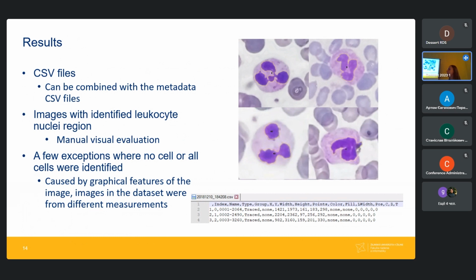Well, this region is what was marked in the labels from the expert. So this is just marked as leukocyte. When the system does the evaluation, we just detect the color, so we detect two, but it's actually one. This is a leukocyte, with the dark nuclei, and these are just red blood cells.